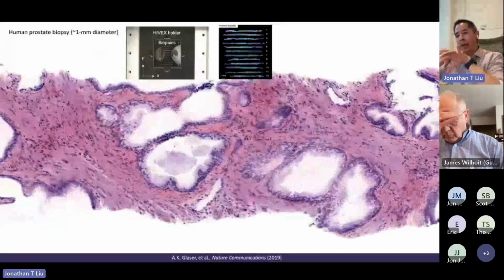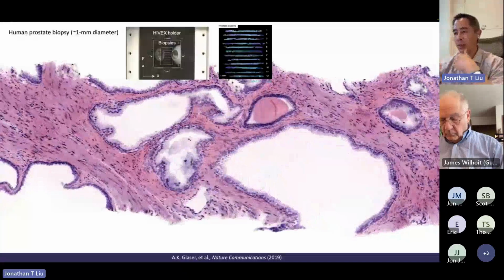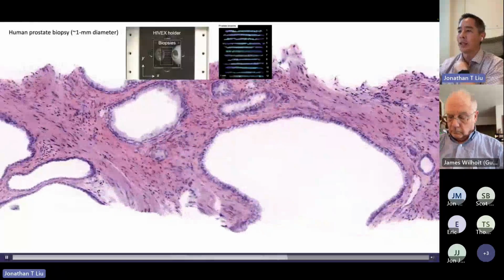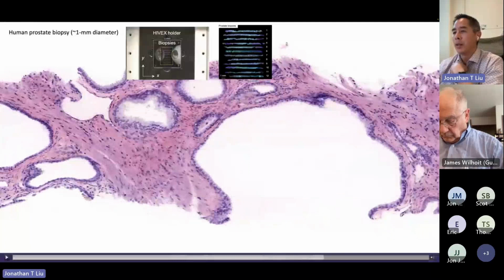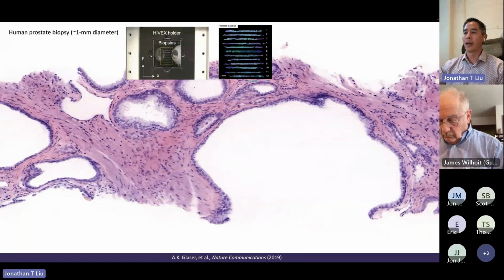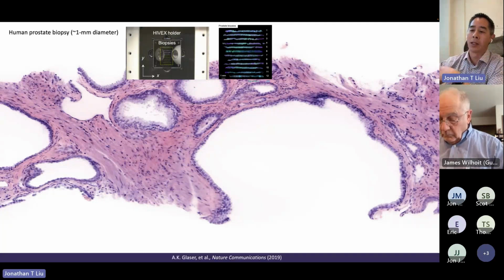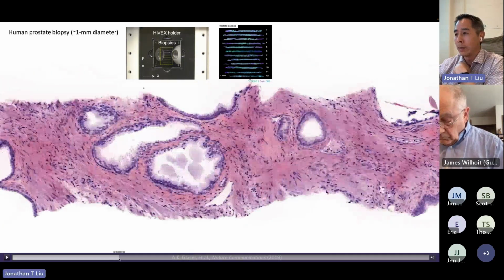Yeah, it's like the branches of a tree that you're seeing, kind of one cross section after another as we go through the depth of the tissue. So you can see that these glands are interconnected. They form this branching tree structure. But if we pause at any one moment, this is what typically they would see as a single cross section on a glass slide. And it can be misleading. For example, there's a type of Gleason pattern 4. You remember, pattern 4 means you have to get surgery or radiation typically. But there is one type of pattern 4 gland. They call it a poorly formed gland. And let me see if I can find an example.